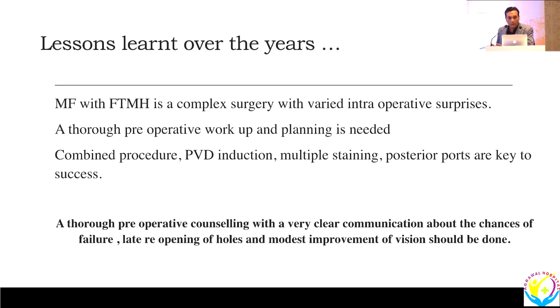Of course, we do all our thorough preoperative workup and planning, but the crux of success is combined procedure, phaco-vitrectomy whenever needed, a thorough PVD induction, multiple stainings, longer stainings, posterior ports around 4.5 will also suffice in axial length more than 30 mm, and of course, a clear communication about the chances of failure, late reopening, and modest improvement should be done to the patient and their attendants.